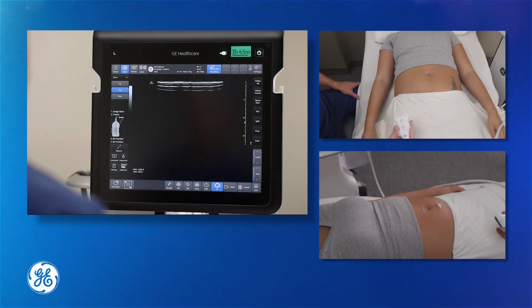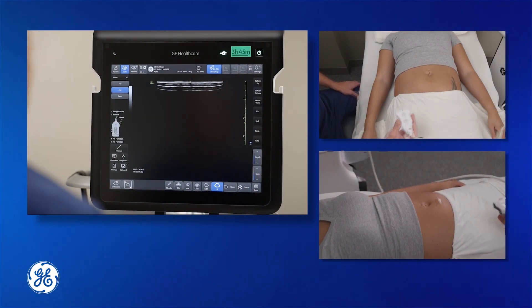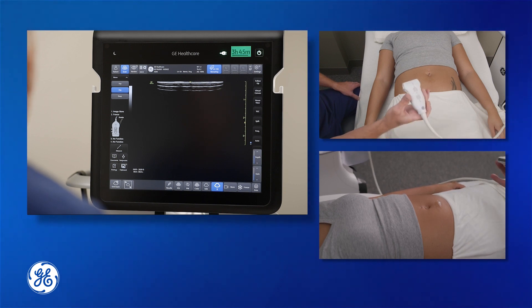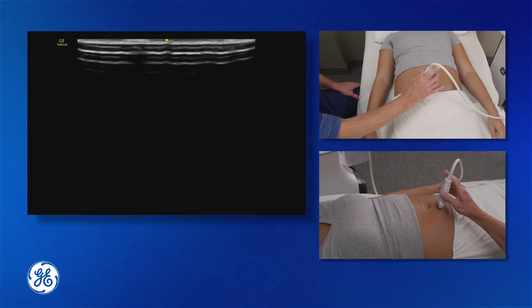We're going to look at the rectus sheath block now for abdominal surgery. We're going to take our probe and place it onto the abdomen in a transverse plane, just below the umbilicus.